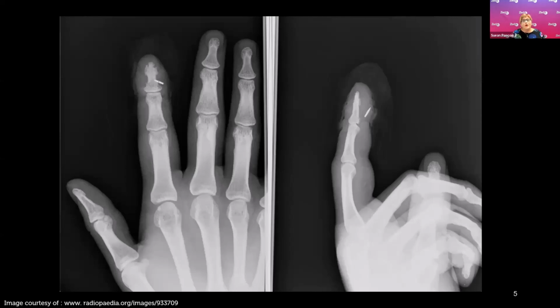X-ray will demonstrate foreign bodies only if there's a difference in the densities between the foreign body and the surrounding soft tissue, and only if that difference is sufficiently high. Metal foreign bodies show up really well and are nearly universally detected on X-ray. But for wood foreign bodies, the difference in density is often too small to be appreciated on an X-ray. In this case, ultrasound is the preferred imaging modality for superficial foreign bodies because of its ease of use, the low cost, and the lack of ionizing radiation. The other great thing about ultrasound is that you can use it to help you remove the foreign body as well.